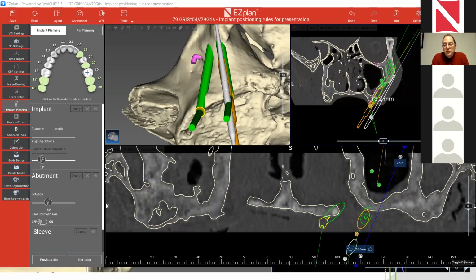But in this case, you could use a finer grit of the diamond and switch to the fine. But the coarse one does the work very well. So you should just try and see. It depends on the membrane, it depends on the case. But if you want to remove material, you want to do it with a coarse diamond drill.